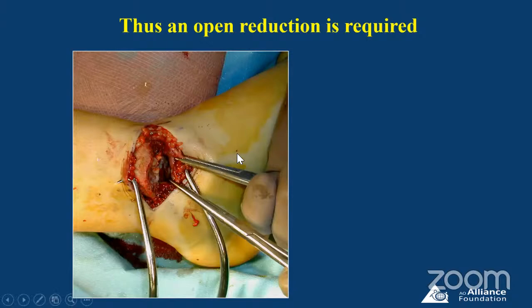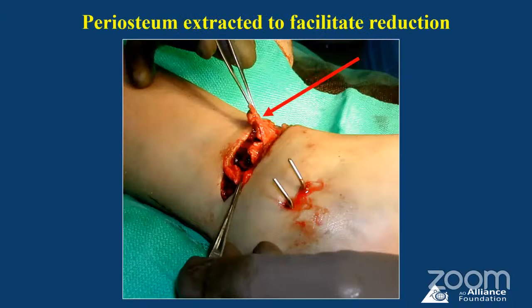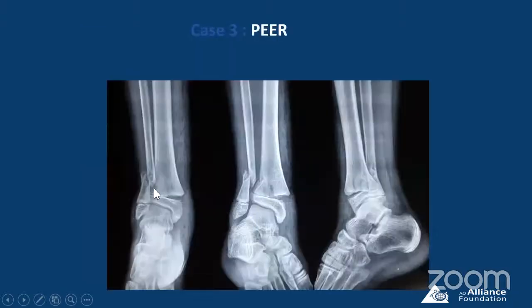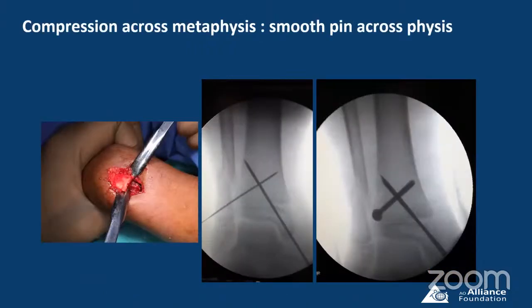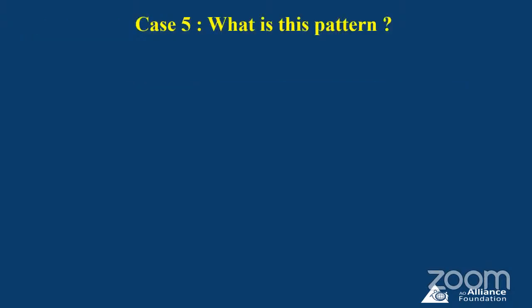So here you can see a very big periosteal flap was incarcerated and that had to be removed, and you can just suture it back after it is removed and pass some smooth pins. Okay, periosteum can be removed from that medial side. So this is an example where we have put a cancellous screw in the metaphyseal fragment and smooth pins across the physis for temporary stability. This is an example of a PER injury, and you can see after excision of that periosteal flap, smooth pin across and a cancellous screw in the metaphysis, and then a cast and early removal of pins. The screw can be removed later and that should restore the function. The fibula will always heal uneventfully.